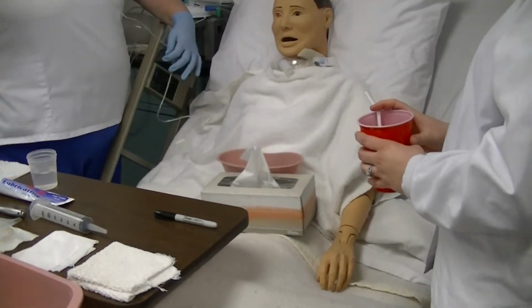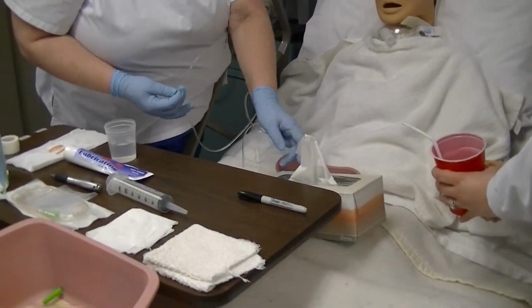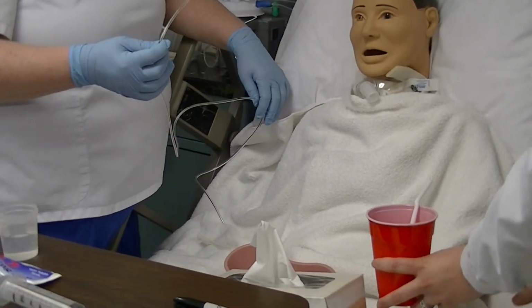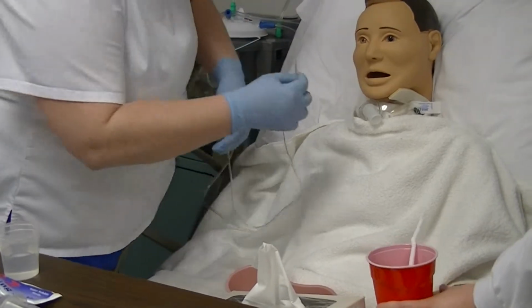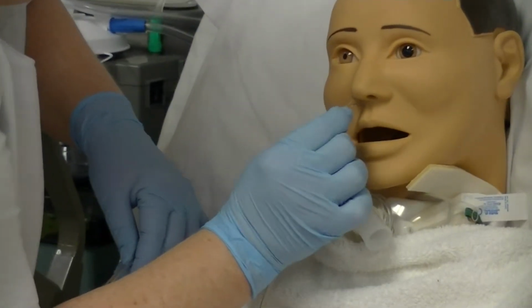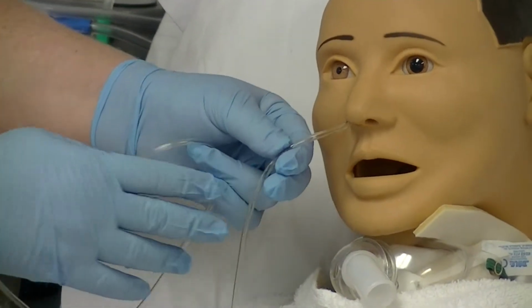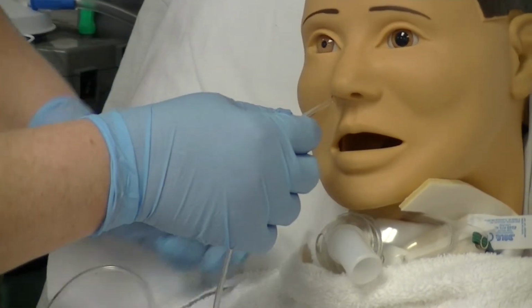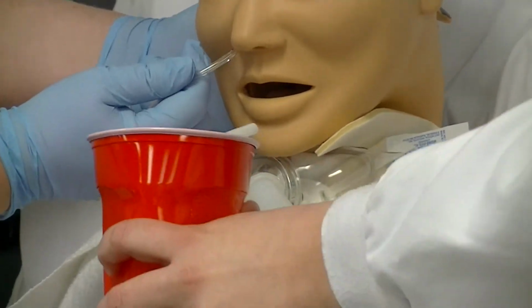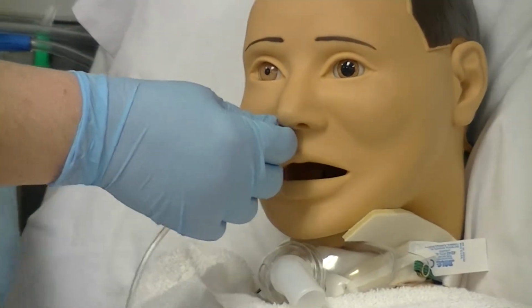Position the patient in a high Fowler's position. Instruct the client to relax his head and neck against the pillow. Insert the tube gently, slowly through the naris, while pointing it backward and downward. With the tube just above the oropharynx, instruct the client to flex his head forward, take a few sips of water, if not contraindicated, and swallow, while advancing the tube 1 to 2 inches as the client is swallowing.